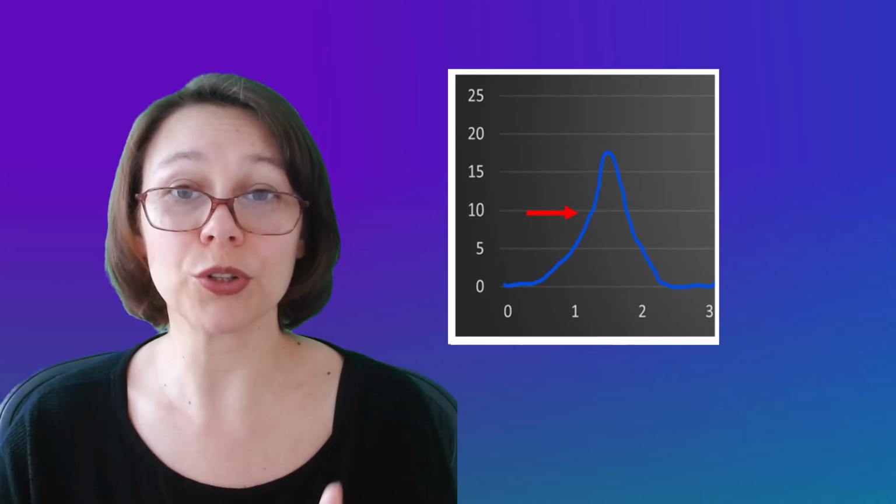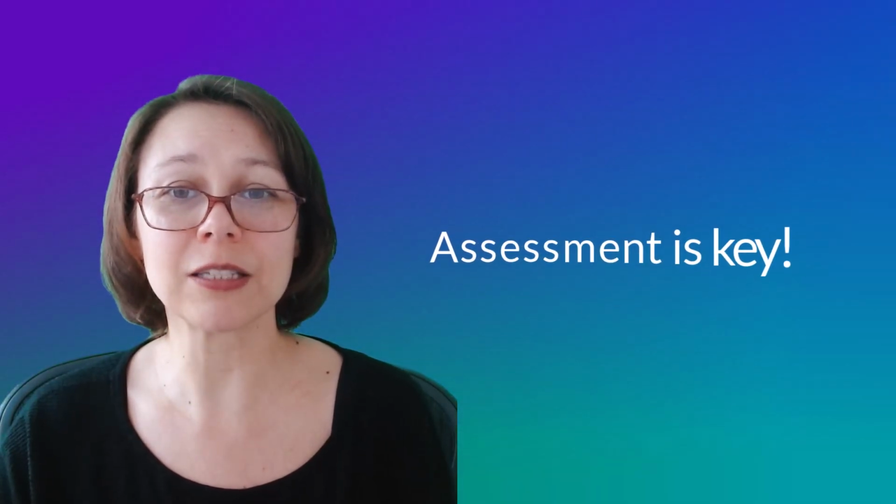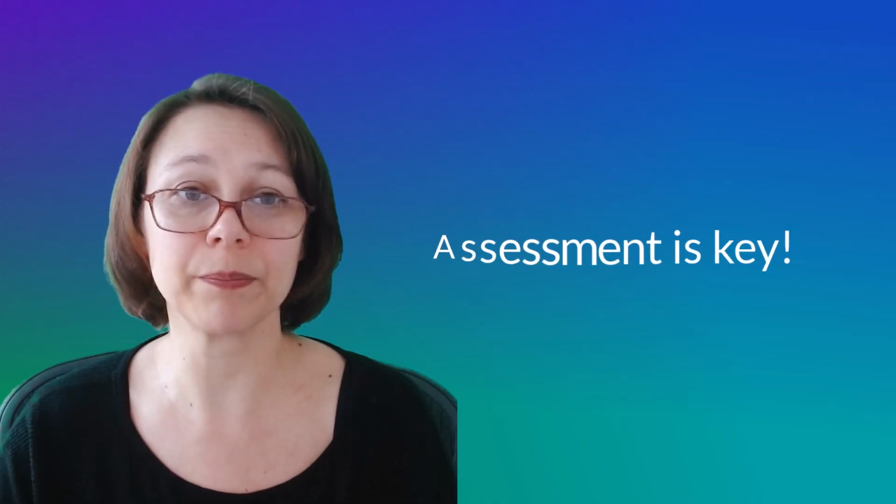If the pressure scalar looks scooped, that could indicate dyssynchrony that requires an increase in inspiratory flow. Or if all settings are appropriate and the patient is anxious or agitated, you may need to consider sedation. Also, being in significant pain can cause the patient to not be in sync with the ventilator. The point is to really pay attention to all possibilities. Patient assessment is key, and that really requires you to look and listen.